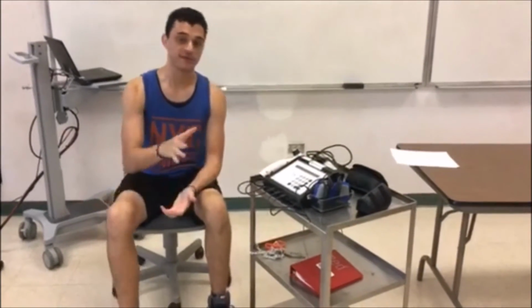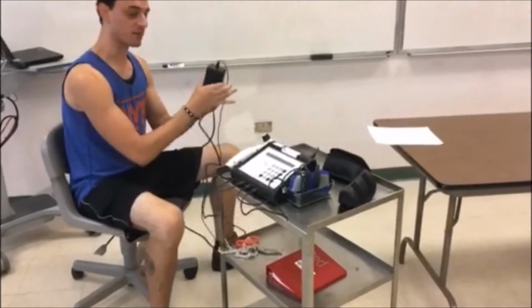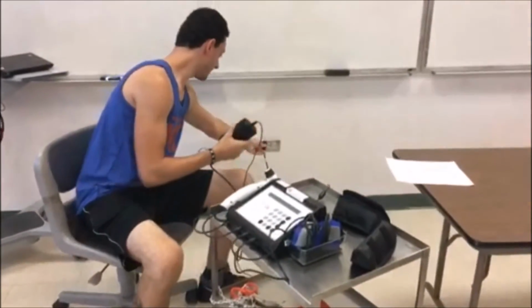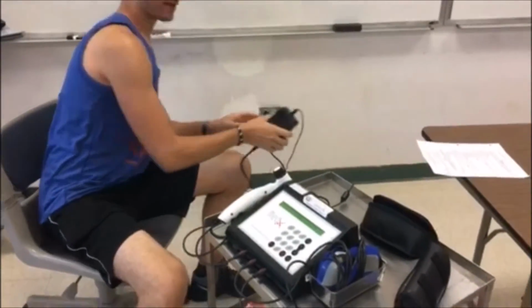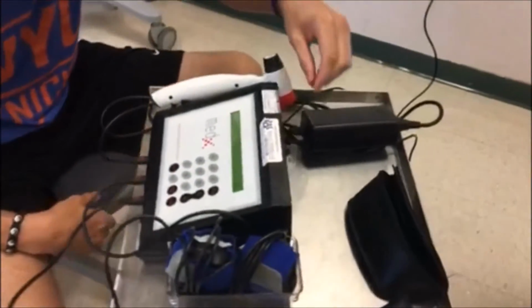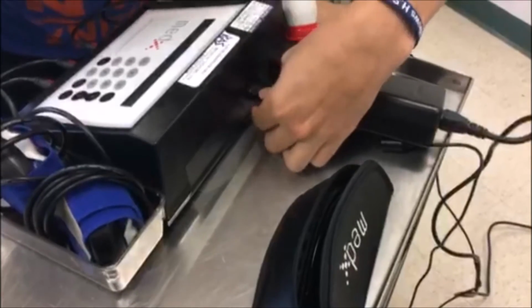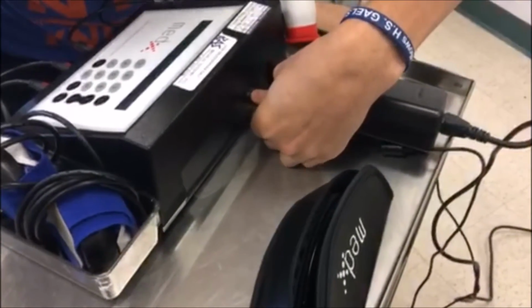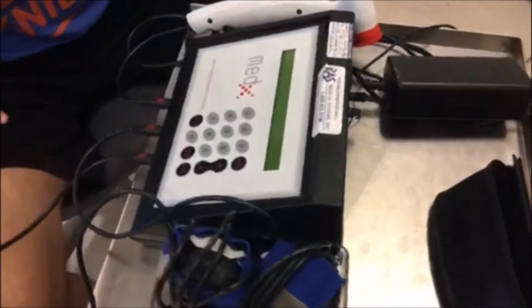Let's go more in depth into the laser machine here. What we first want to do is plug the machine in. So we have our bigger plug back here. There's also a key in the back of the machine, so we want to make sure we turn that. I just turned it off for turning's sake, but I'll turn it back on here.